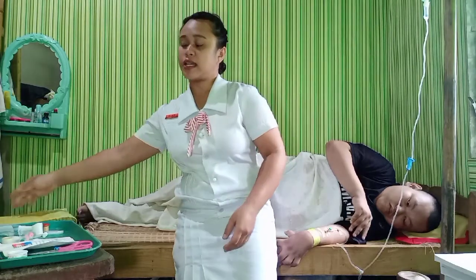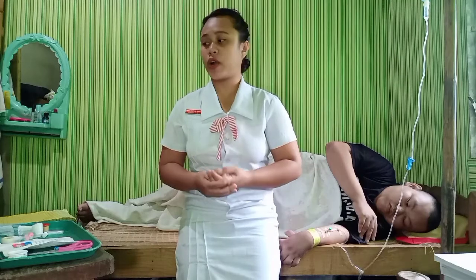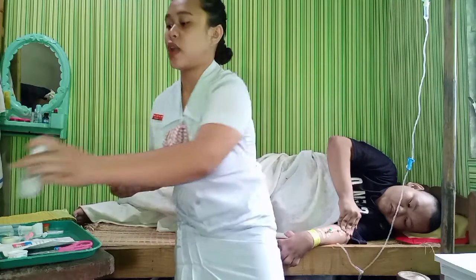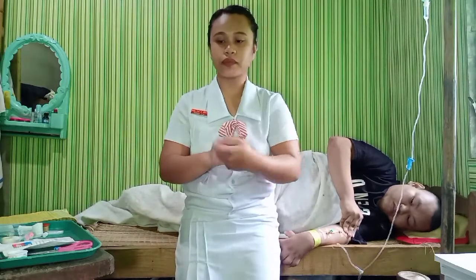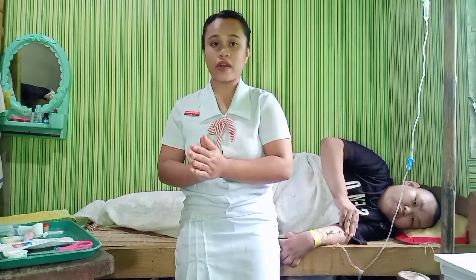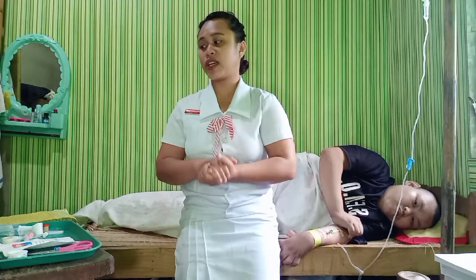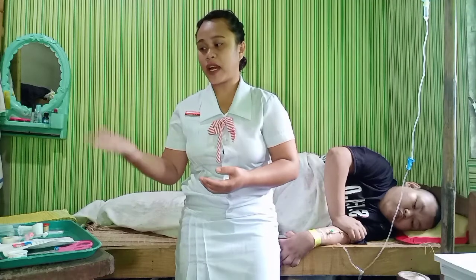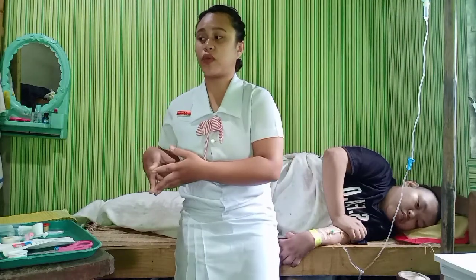Afterwards, we are going to wash our hands, or if not, perform hand hygiene through the use of alcohol. Then we are going to prepare all the materials needed, which are the sharp container, the gloves, the alcohol, the plaster, and the cotton or cotton swabs. After that, we need to put all the equipment to the bedside of the patient.